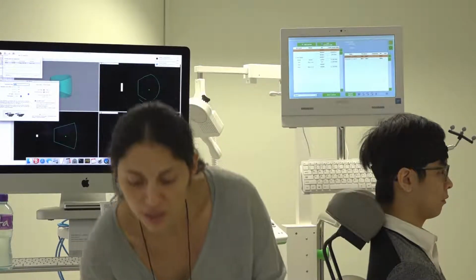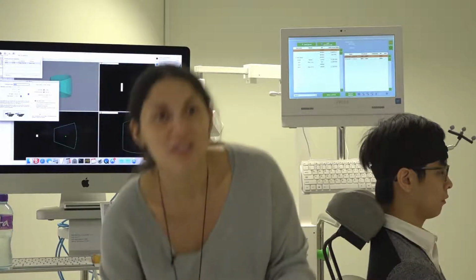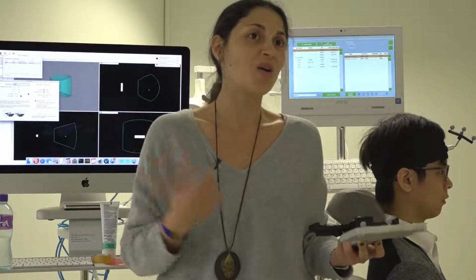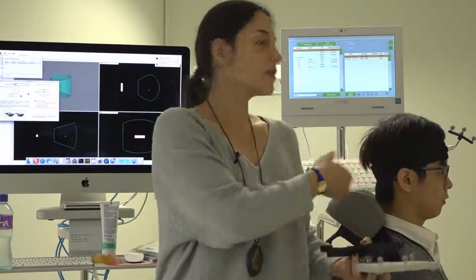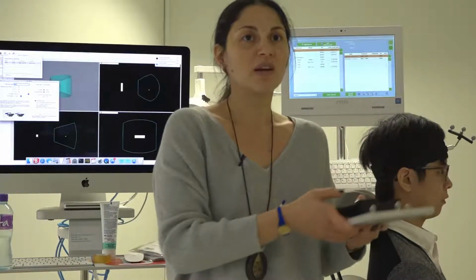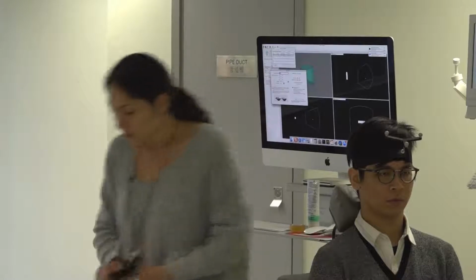So I can leave this outside. Thank you. Normally, well, this is not very elegant for the camera, but when I'm in my lab, I can do it on my own, and I support the things. Here I cannot because this is an open space, but I have ways to do it there. You have here a pedal. I don't know why it's not working. Normally what you could do is just click here and it will work. I don't understand. It should work.